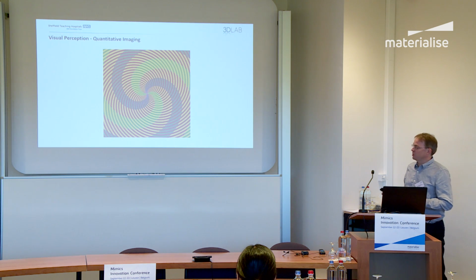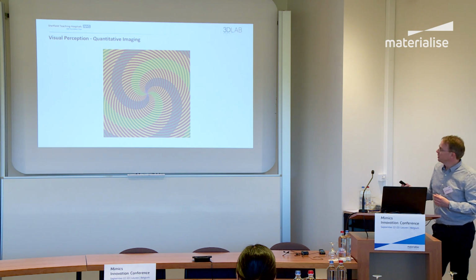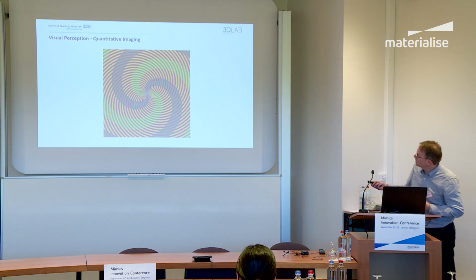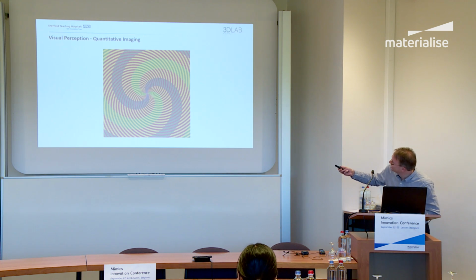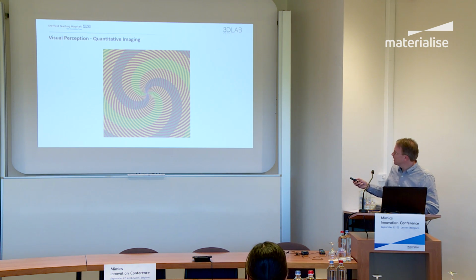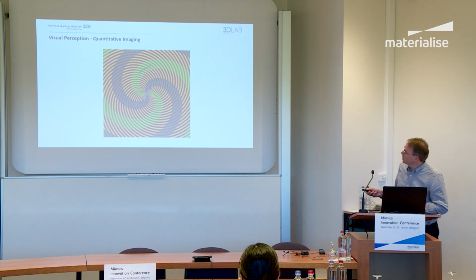And we have the same issues when interpreting colour. It's a slightly weird colour on this display, but basically we've got yellow and magenta swirls interlaced by, on this screen, blue and green. You see the bluish swirl there, and there's a green swirl there. Well, actually if I move part of the blue onto the green, it is actually the same colour as the green. On this screen it is.